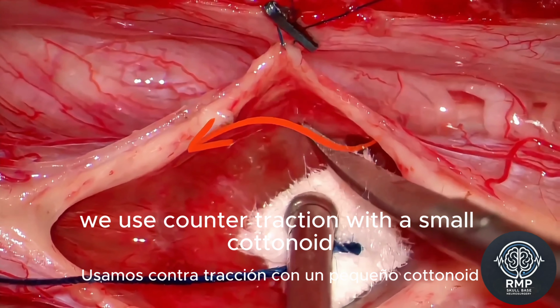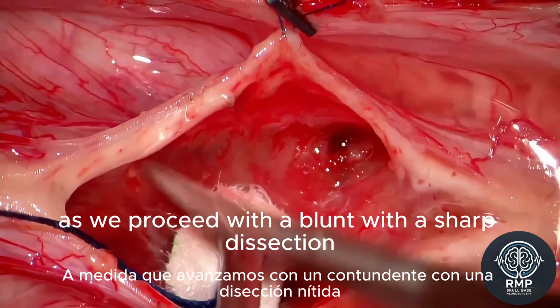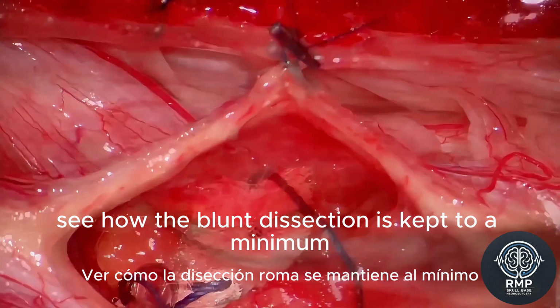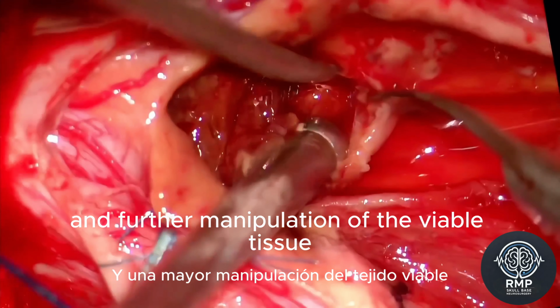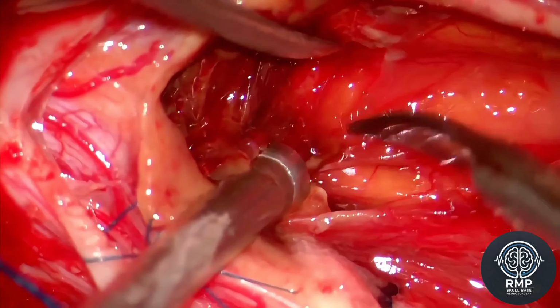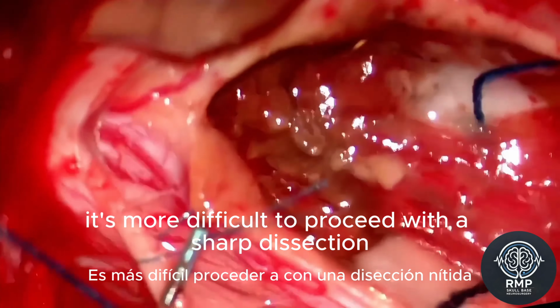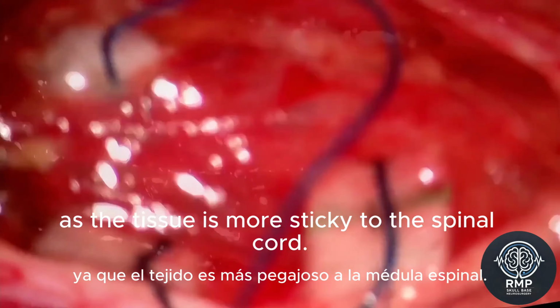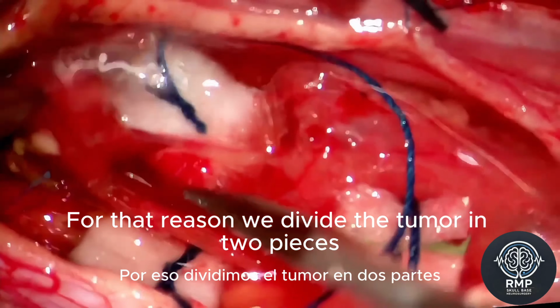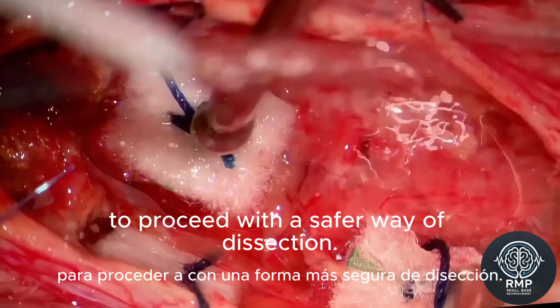We use countertraction with a small cottonoid as we proceed with a sharp dissection. See how the blunt dissection is kept to a minimum to avoid tissue laceration and further manipulation of the viable tissue from the spinal cord. Here in this area where we can see the blood clot, it's more difficult to proceed with a sharp dissection as the tissue is more sticky to the spinal cord. For that reason, we divide the tumor in two pieces to proceed in a safer way of dissection.